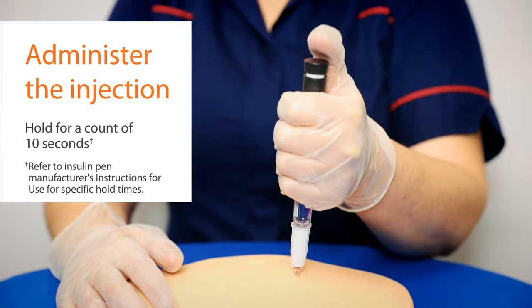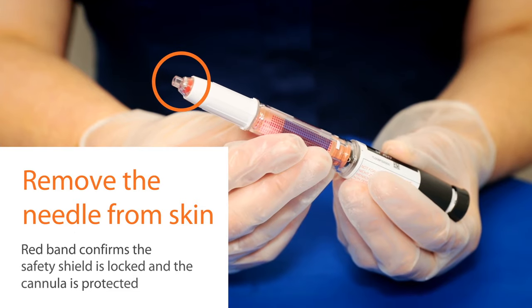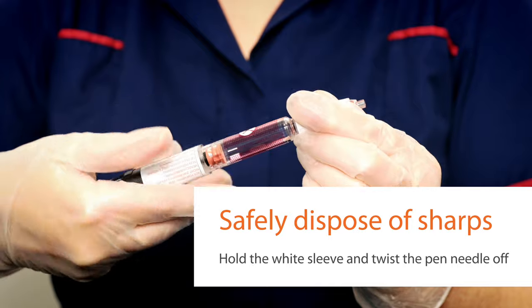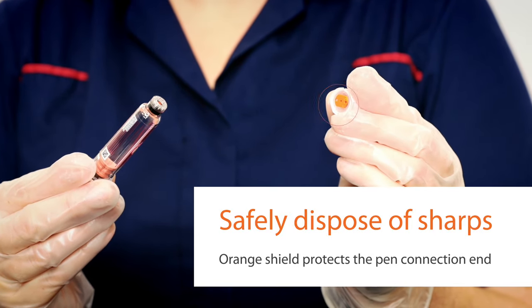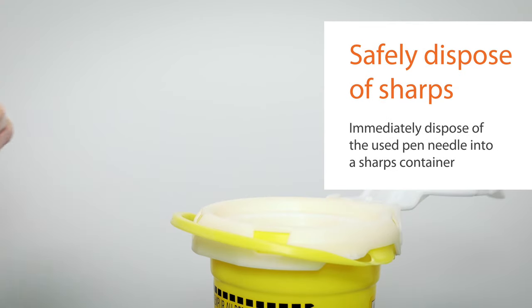Lift the pen from the skin and confirm that the dose window is at zero. The red band indicator shows that the safety shield is locked. Hold the white sleeve of the pen and unscrew by twisting the pen — the pen connection end of the needle is now protected by an orange shield. Immediately dispose of the used pen needle in a sharps container.